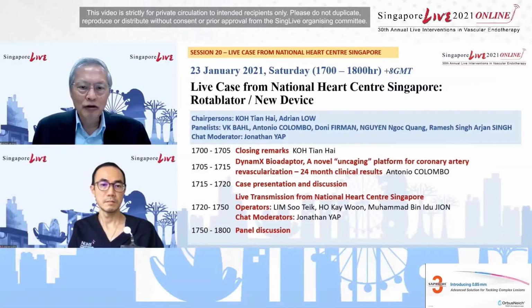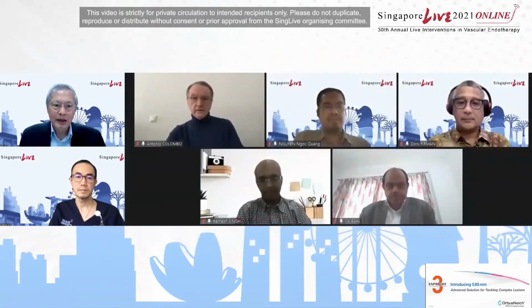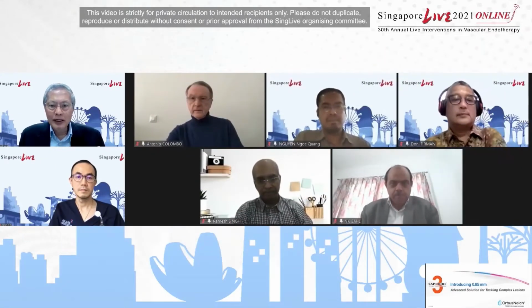Thank you, Antonio, for teaching us about this new device, new stent, this bioadapter, and we want to hear from your experience during this case. So maybe we can go to the cath lab, and we have all our panel members here.